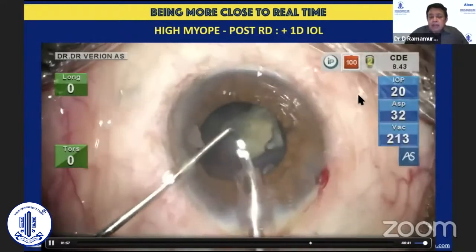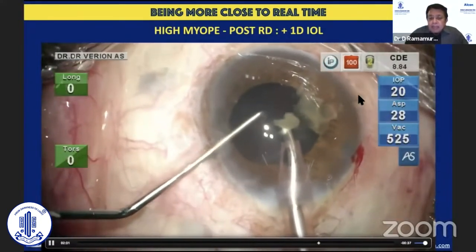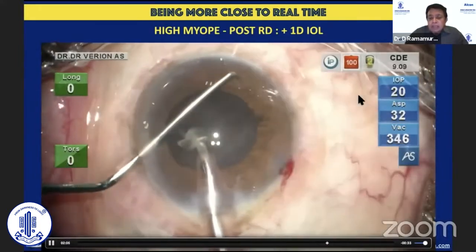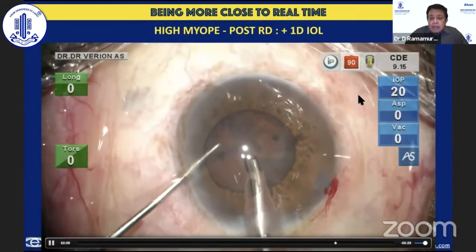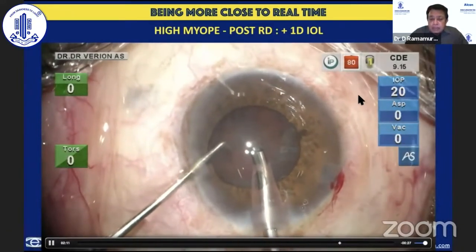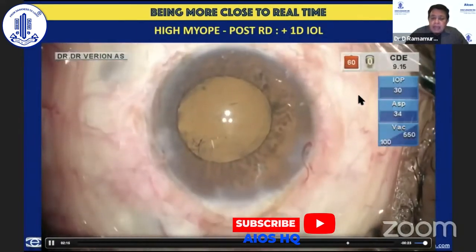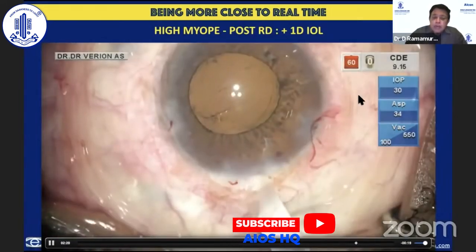And you can see the stability of the anterior chamber that's achieved by the integration of these specific technologies. And that's the nucleus that's completely been removed. Subsequently an intraocular lens is injected, and because a 3-piece lens is what goes in, I need to enlarge the incision from the initial 2.4 millimeters to about 2.8 millimeters.